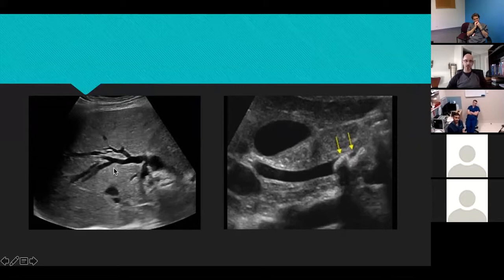When there are two quite similar sized tubes next to each other, it means that the intrahepatic biliary duct is quite enlarged, and that's called the double track sign, or train track sign, and it's a sign of intrahepatic duct dilation.